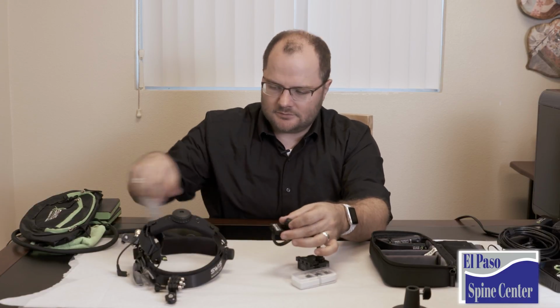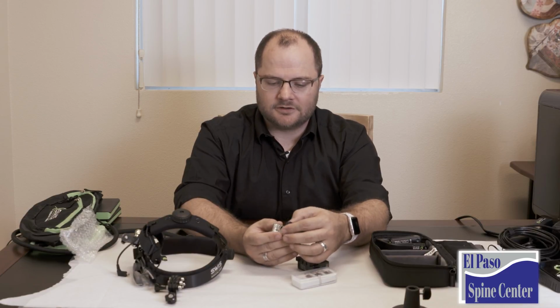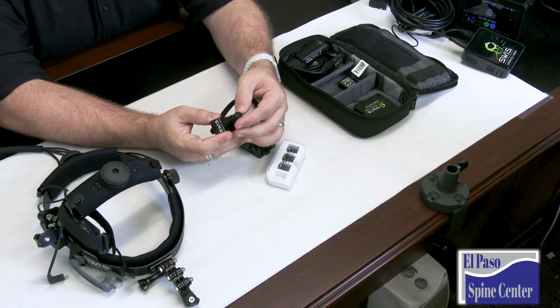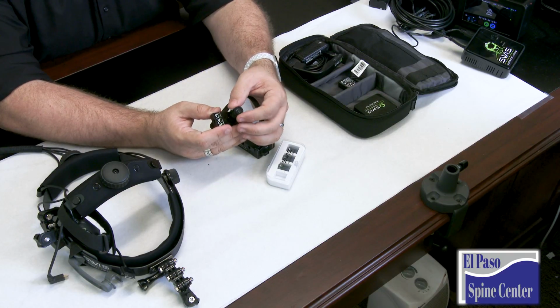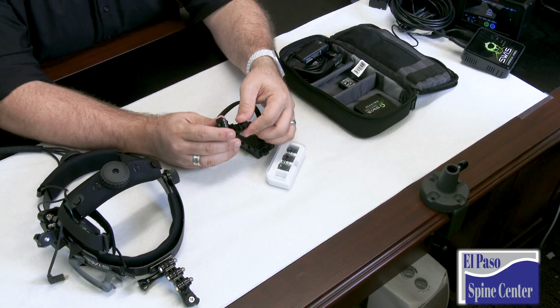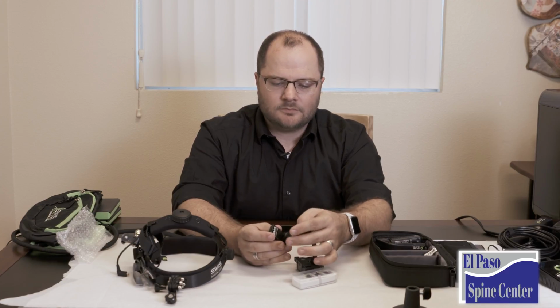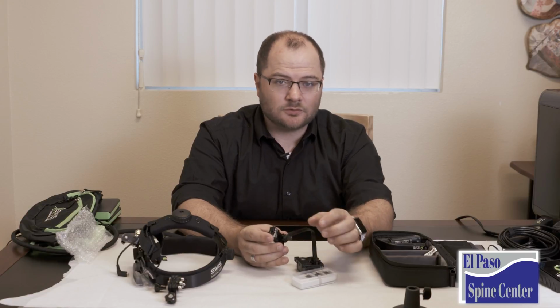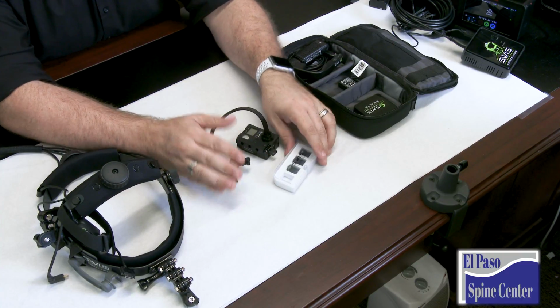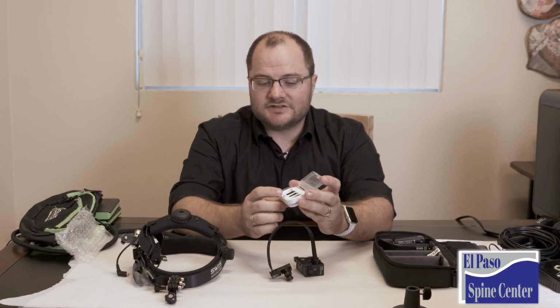Go ahead and unscrew this real fast. I'm going to be careful with this sensor because I don't want it uncovered very long. I don't want anything to get on the sensor. When you remove the lenses to replace them, try to be careful about getting anything on your sensor that can really mess up your images. There's an adapter so you can actually get your focus where you want it for all of these lenses. But they simply screw in, and the tighter you screw them in, the more it's going to affect your focus. So before you get into the sterile field, make sure you set your focus and check what you're recording before you go in, because you don't want a full video of just an out of focus shot. That wouldn't be any good. You do get several different lenses in here as well.